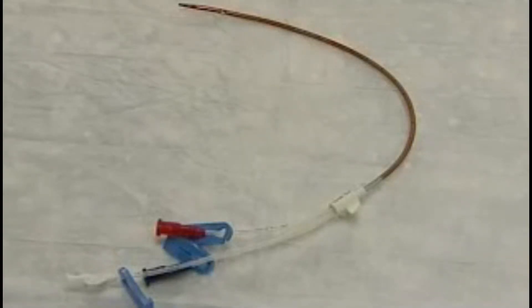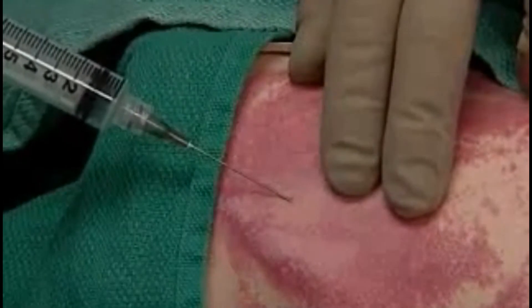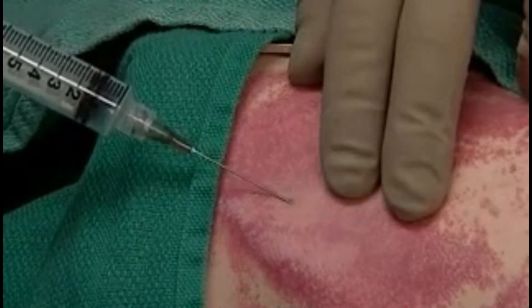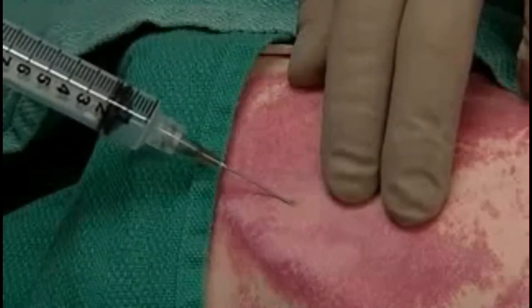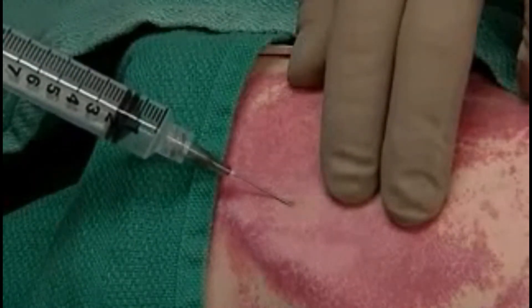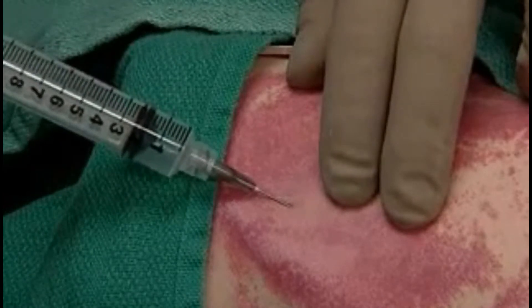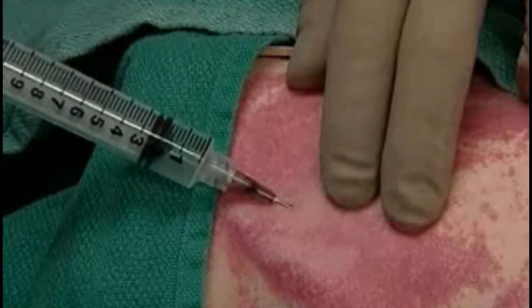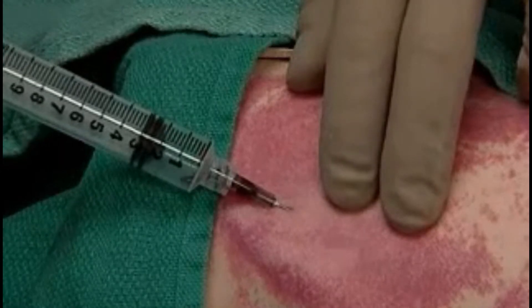This is the catheter — note the centimeter markings. Gently palpate the carotid and insert the finder needle at the apex of the triangle, advancing slowly and staying lateral to the carotid. The trickle of blood shows we're in the jugular.